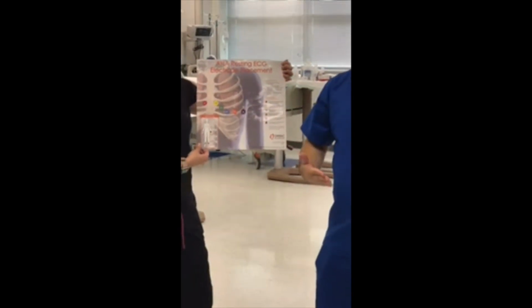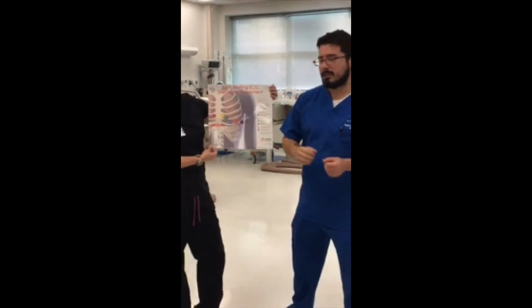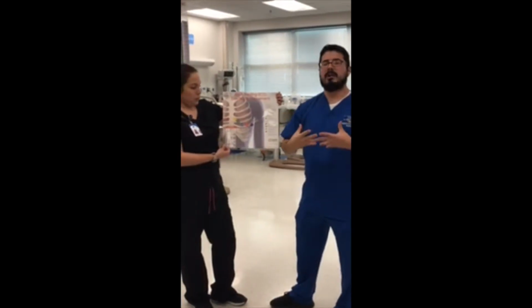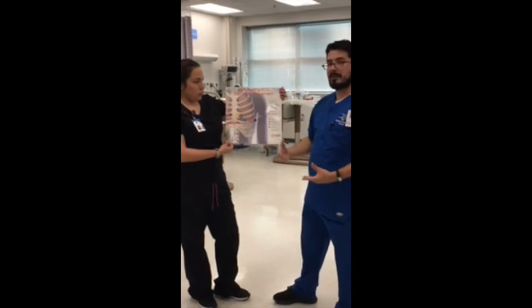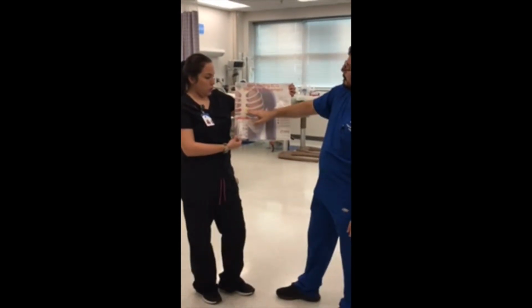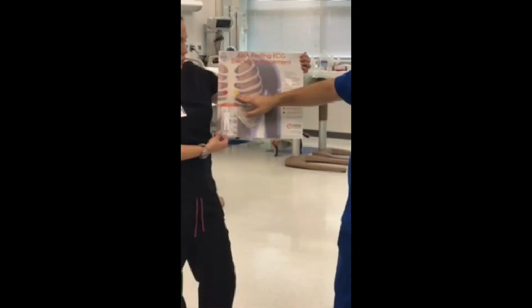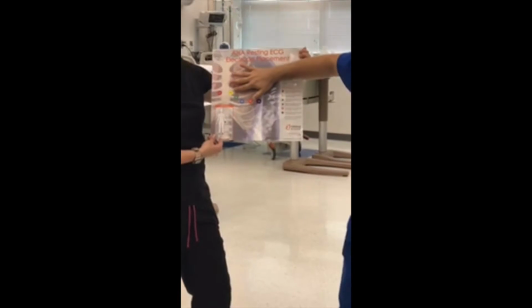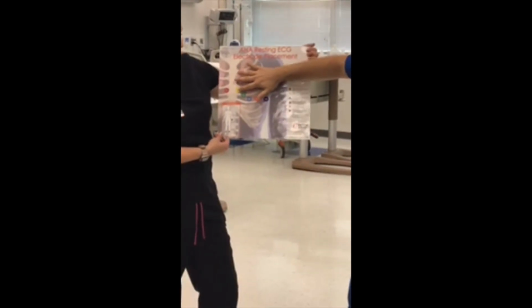Just a great rule of thumb, we never want to put a lead directly on a bone because the density of the bone may interfere with the signal in which the leads pick up the electrical conduction. So V1 in the fourth intercostal space. V2 directly across the sternum, again, 1, 2, 3, 4, fourth intercostal space.